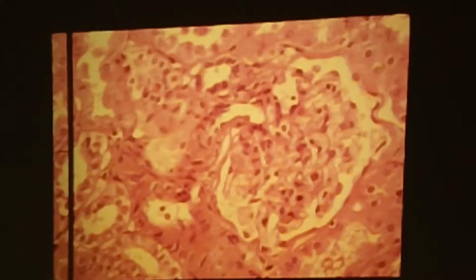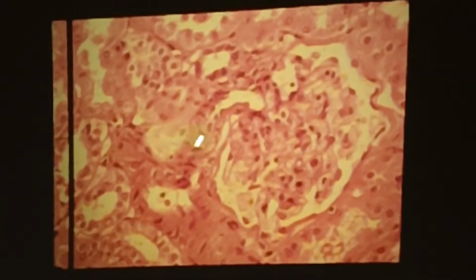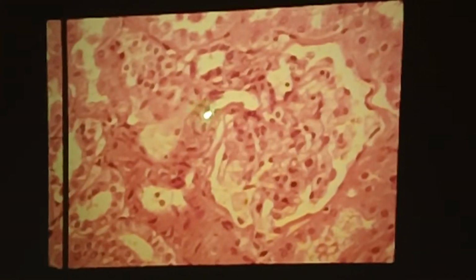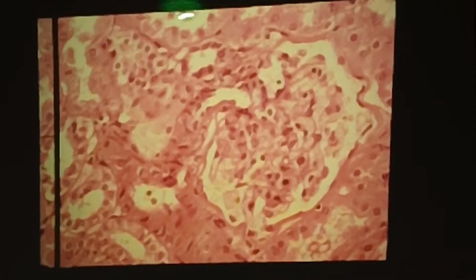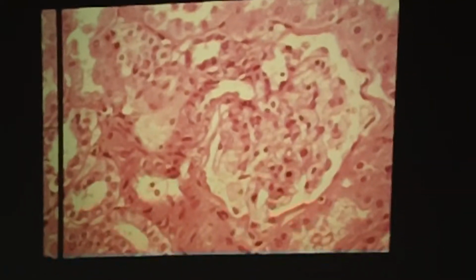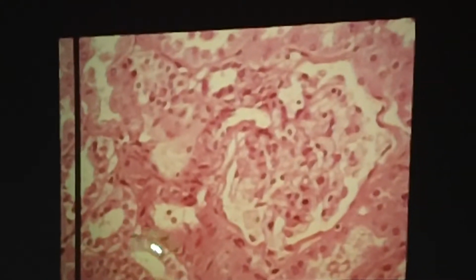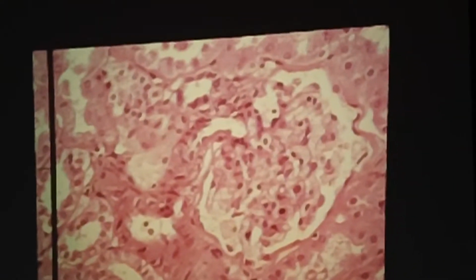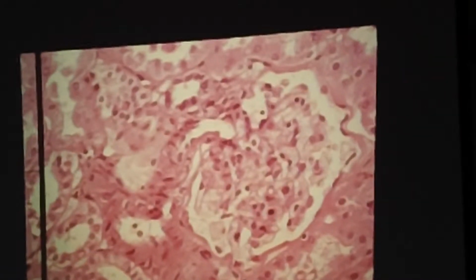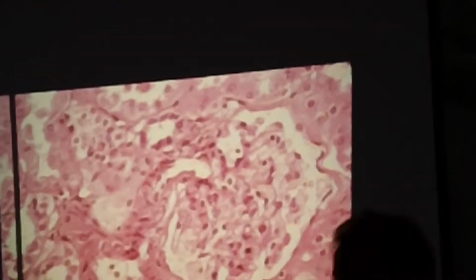Okay, do you see evidence of a juxtaglomerular apparatus in this image? Yeah. Here's your macula densa. And look, we just cut through the wall of this afferent arteriole, and here, a little further on, we've got the lumen. So this is a vascular pole. This would be the region of the urinary pole, but we're not seeing the continuity with the proximal convoluted tubule. You think that's a distal or a proximal convoluted tubule right there? Distal. Yeah, because the luminal profile is pretty clean right here.